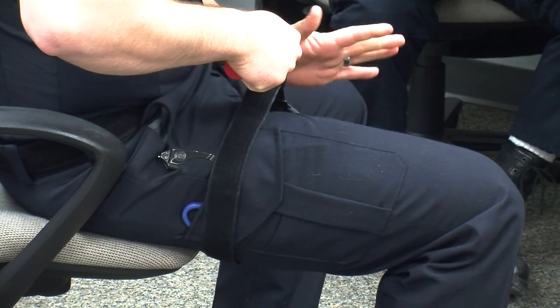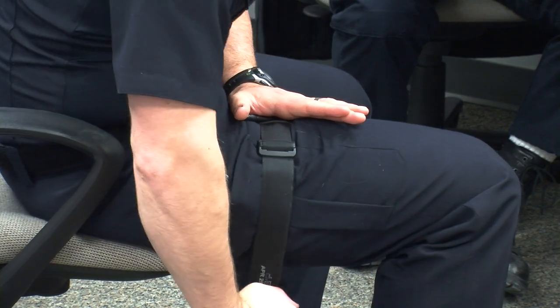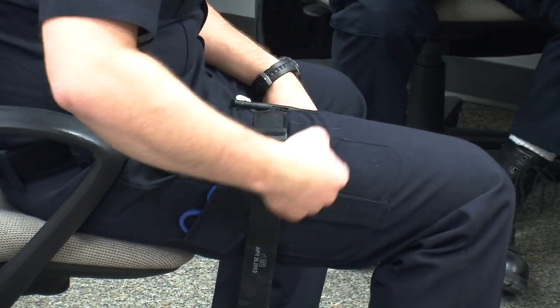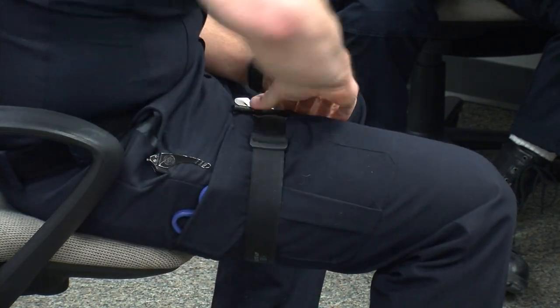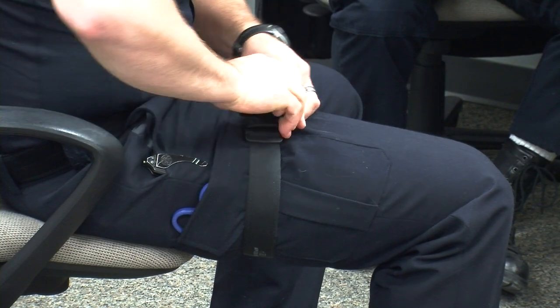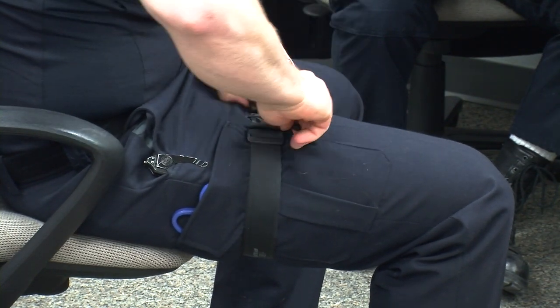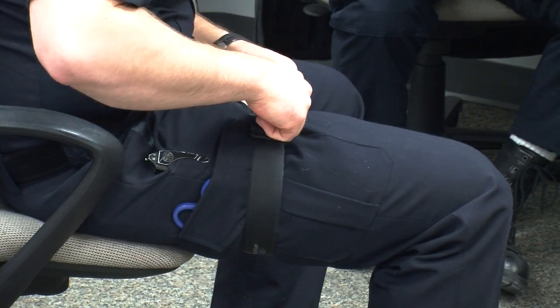Through the second loop, and the easiest thing is to push down here when I tighten it, otherwise it just goes right around the leg. And it becomes a pain in the butt. Put it back on itself, and same thing, start cinching it down. And on the leg, basically, you get it as tight as you can get it, basically until it hurts.